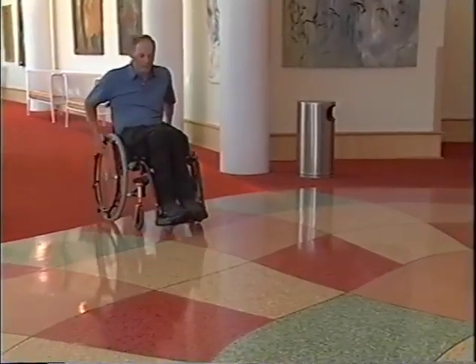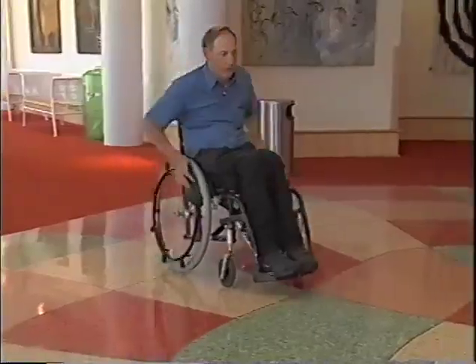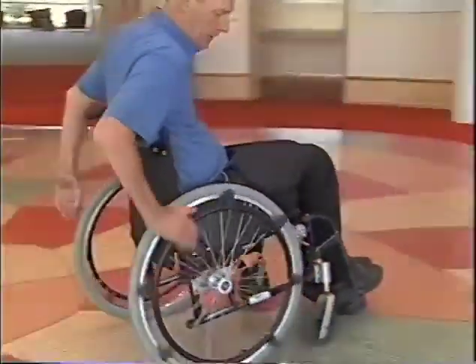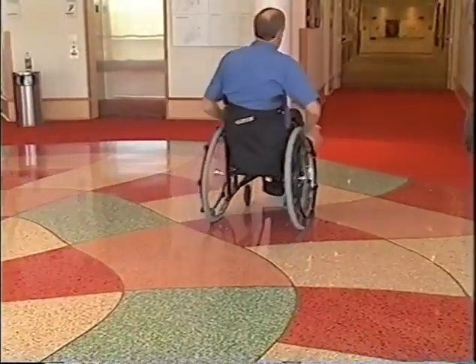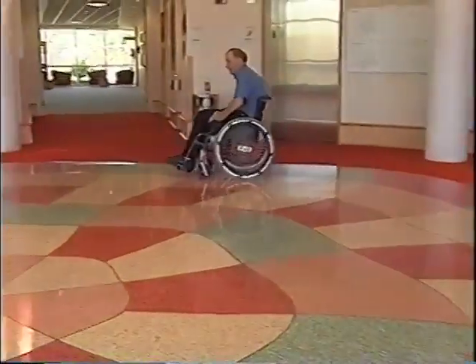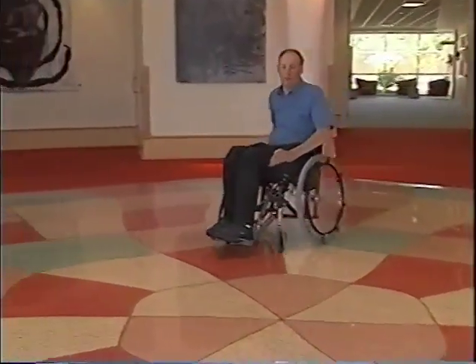You can see I haven't been doing this for years, but I wheeled with projections for 3 years after I got hurt, and they're very helpful. But it takes a little getting used to learn how to coordinate your hand.